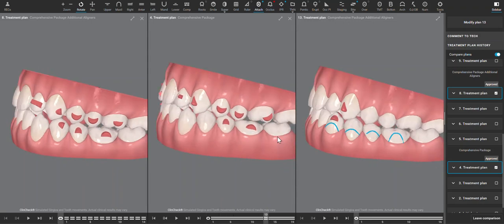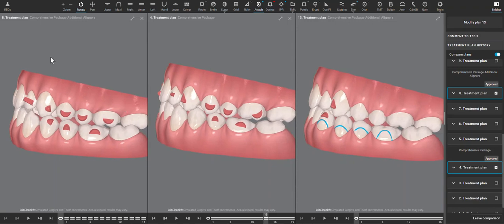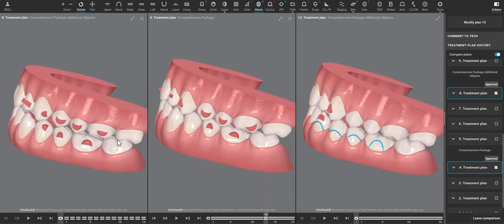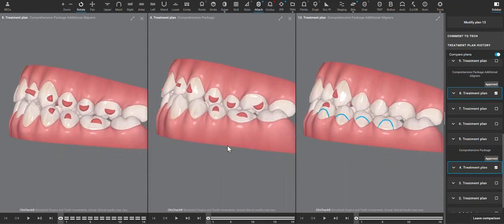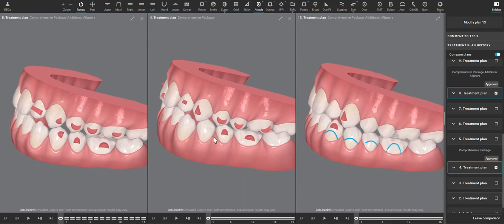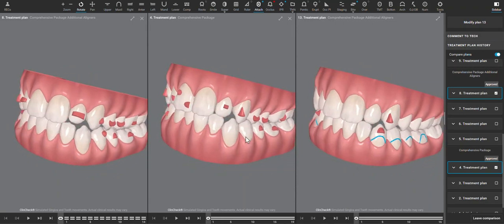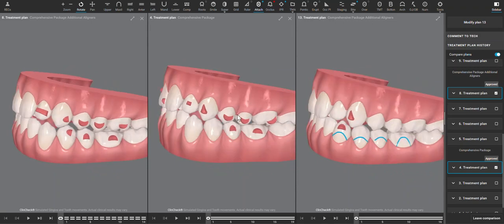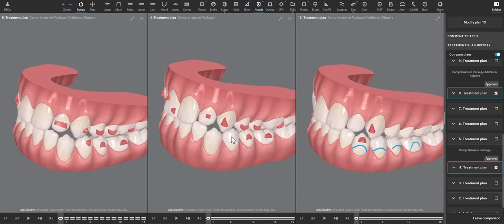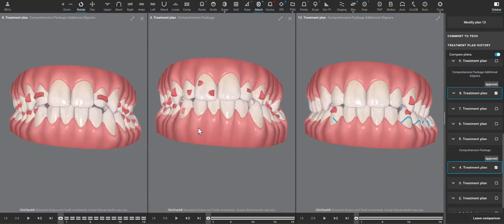Looking at the next ClinCheck on the left hand side, we can see that those movements absolutely did not happen. It looks almost like these premolars didn't really work at all. The crossbite correction—the crossbite's still stuck here—but the lower anterior alignment certainly improved.